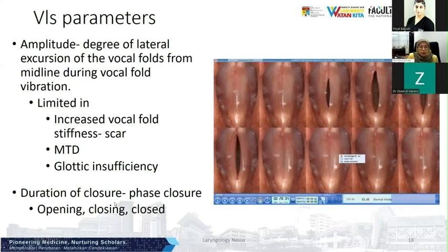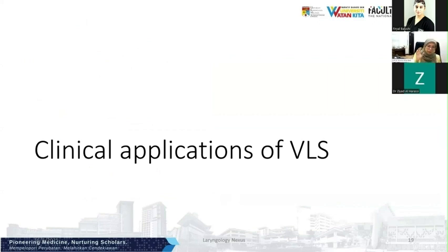This is again the duration of closure in a montage. You look at the phase closure, whether it is predominantly closed, predominantly open, or half open, half closed. So this is how you can standardize the way you assess and document the findings of your laryngostroboscopy.